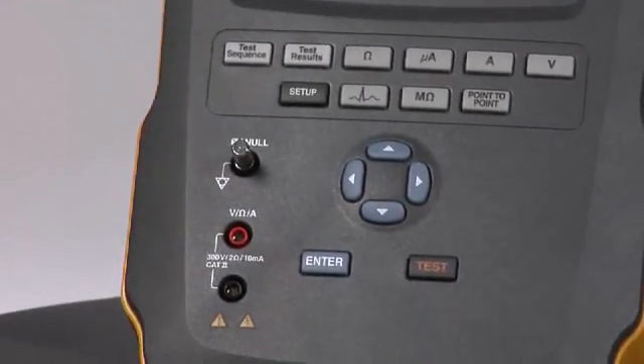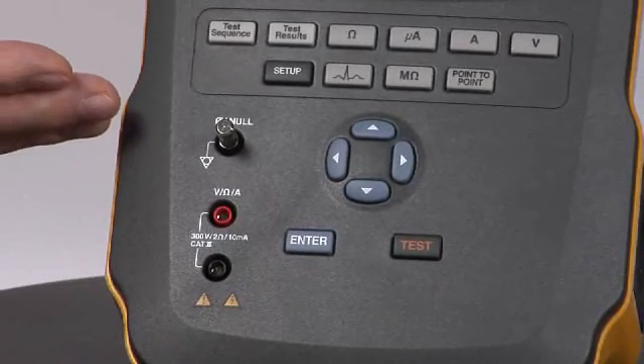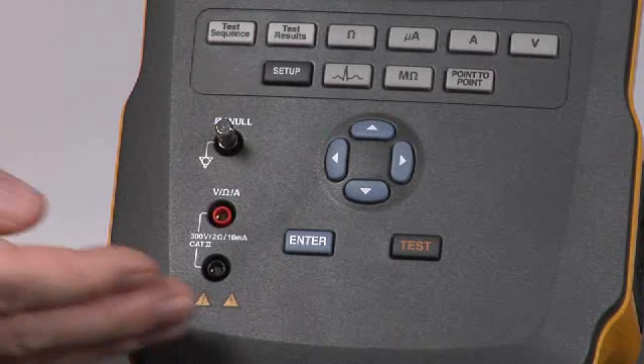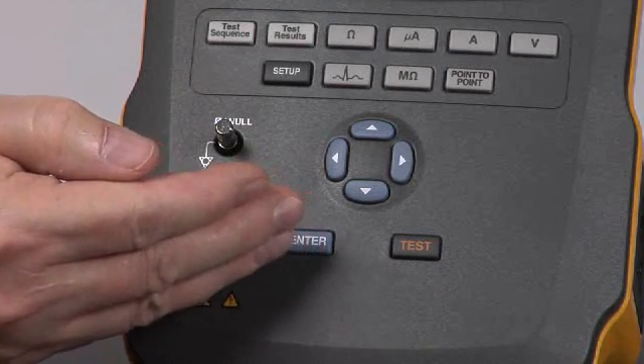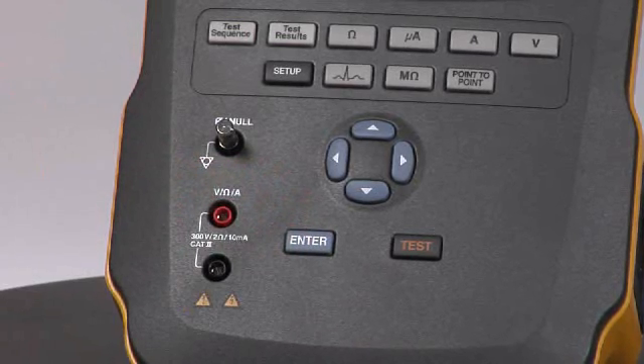Rotating around to the front, we see the connections for your test probes and the null pin for zeroing our test leads. Moving across the front, we see the navigation array and the test button for running our higher voltage tests.